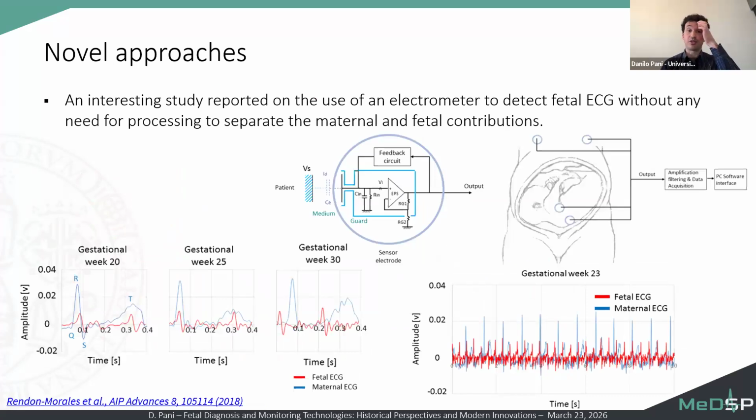Other novel approaches in this field are based on the use of electrometers to detect the fetal ECG without any need for processing to separate the maternal and fetal contribution. However, this technology is not in the market, so it's still at research level.